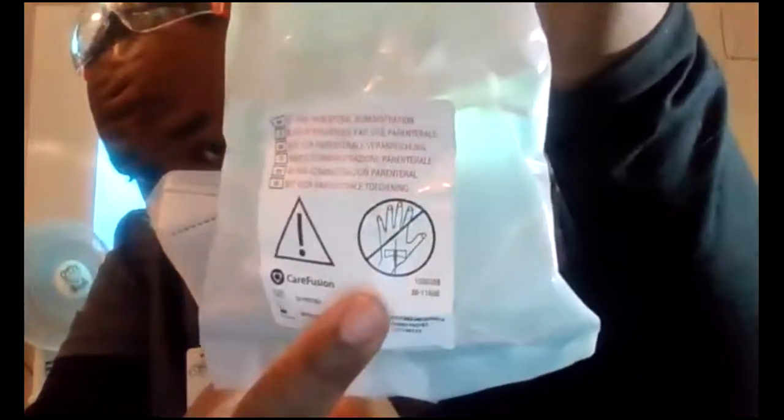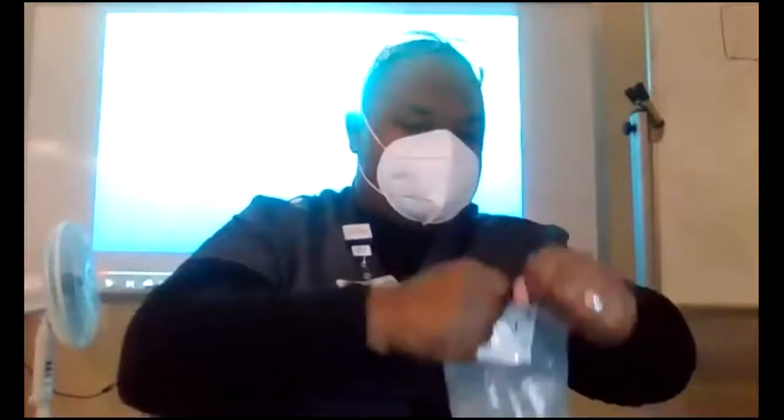Not for what? Not for IV. This is not an IV bag. This is for, what's that say? Inhalation only. All right? So I would have my water bag.